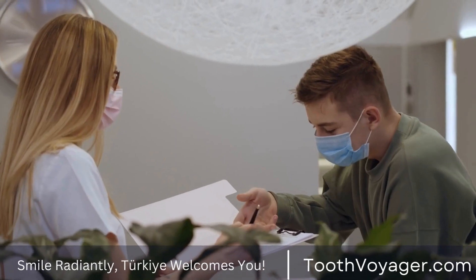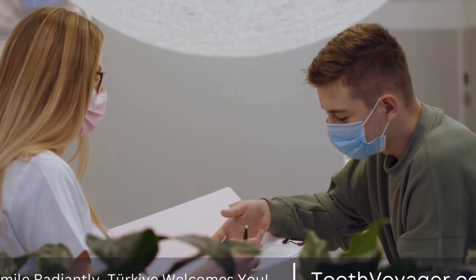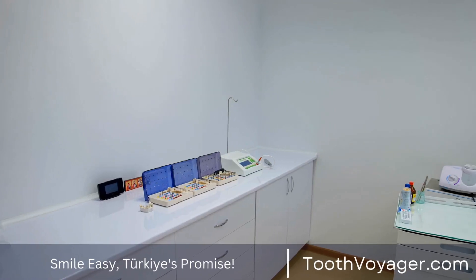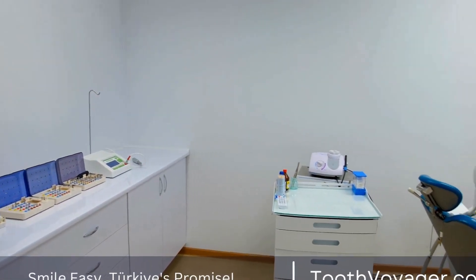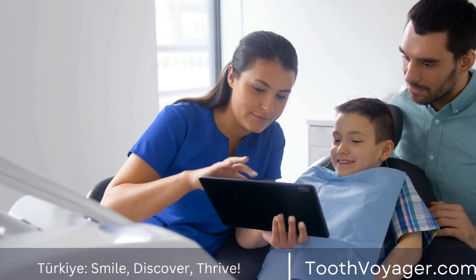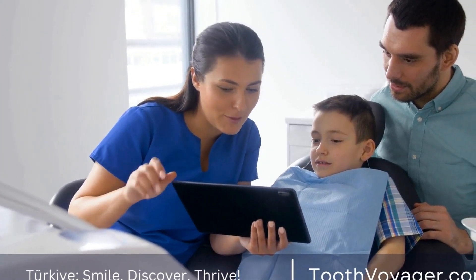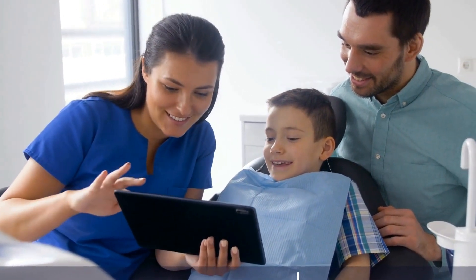Once the bridge has been fabricated, you will return to the dentist for the second visit to have it installed. The dentist will first check the fit of the bridge and make any necessary adjustments before cementing it in place. The pontic will be attached to the crowns on the abutment teeth, creating a seamless and natural-looking restoration that fills in the gap left by the missing tooth or teeth.